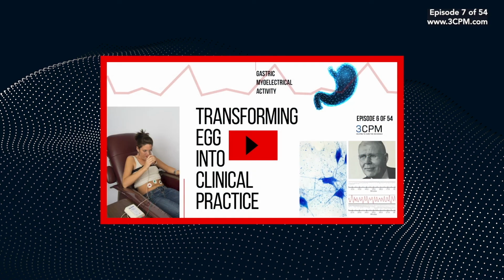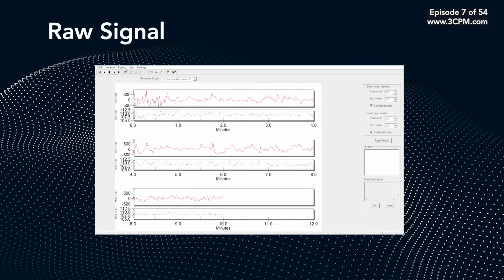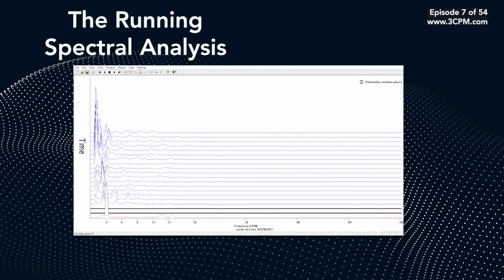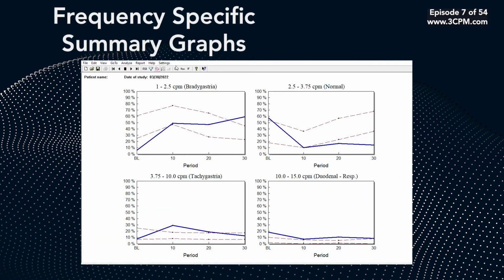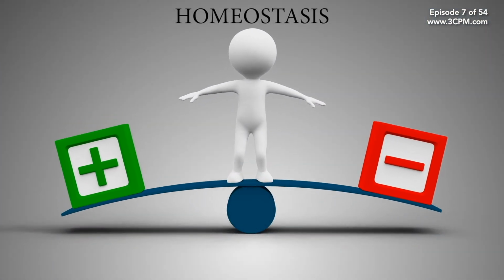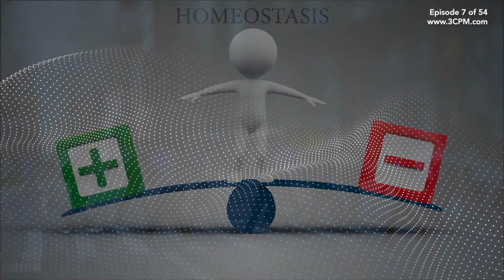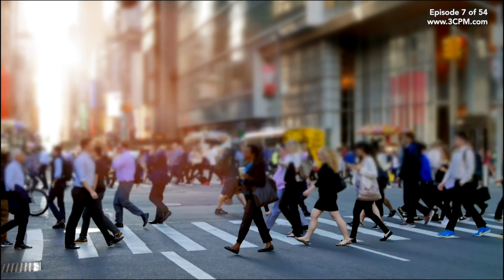In our last video, we talked about how it was possible to analyze the EGG signal, yielding components such as the raw signal, the running spectral analysis, and finally frequency-specific summary graphs, to help compare the EGG signal to better understand disease. In order to understand the difference between normal and unhealthy conditions, or stated another way, homeostasis or disease, it is necessary to first define the normal limits.